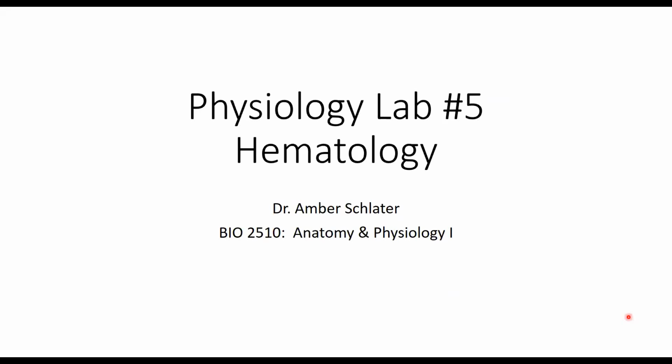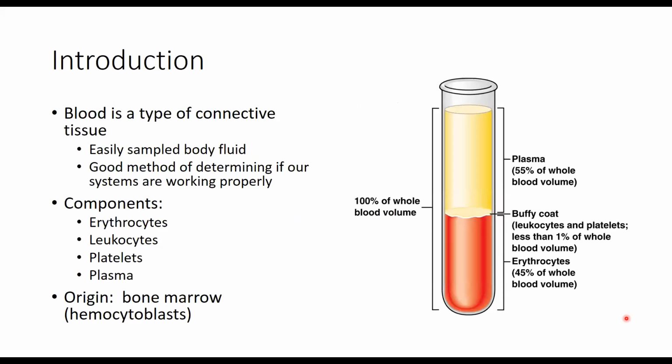Our fifth and final physiology lab for the semester is a lab on hematology. And hematology is the study of blood in all of its different components. In lecture, we haven't yet spoken about blood and all of the different components of blood. We'll get to that pretty extensively in the spring semester early on.